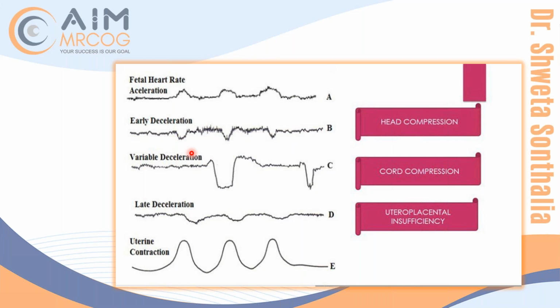Can anybody tell me when early deceleration comes? What stage of labor? Second stage of labor. Second stage. Will it always be with second stage?